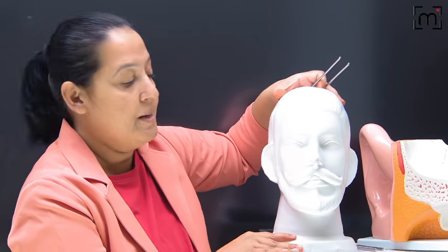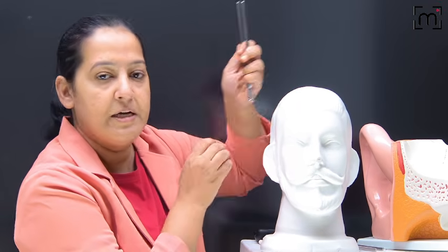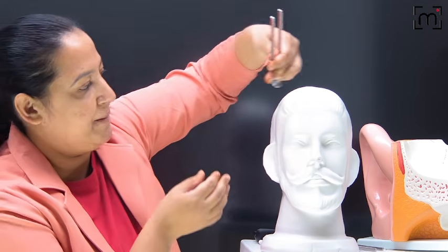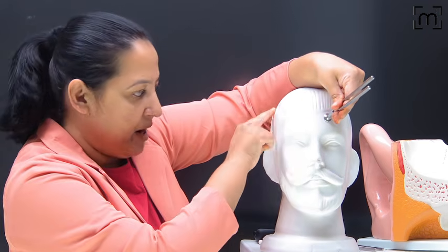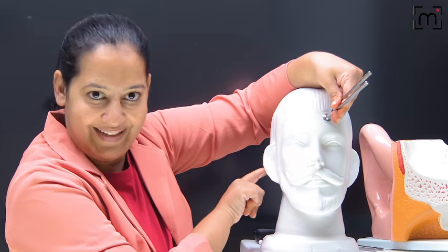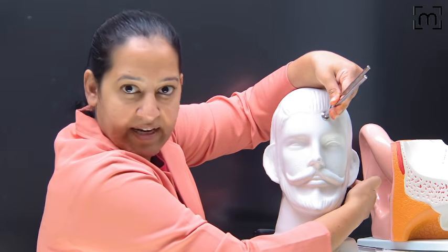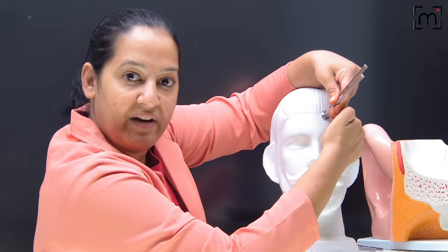You are getting my point. But suppose in this ear, the patient is having sensorineural deafness. So again, perform Weber. Take the tuning fork, activate it and keep it on the vertex. Sound waves are coming here but not activating the cochlea completely, because the patient has sensorineural deafness, a defect in the cochlea. And on this side it is going and 100% activating the cochlea. So this side the patient will hear better.